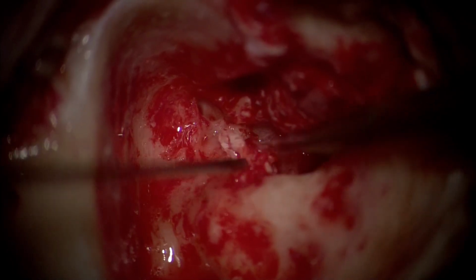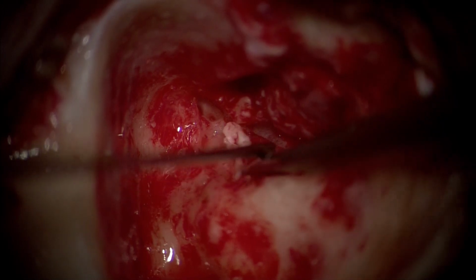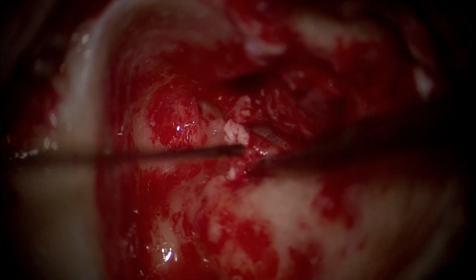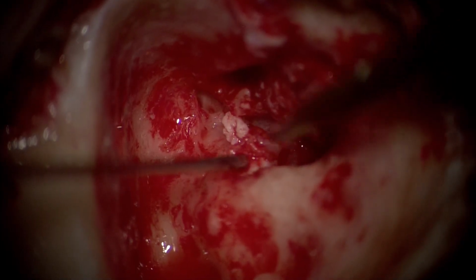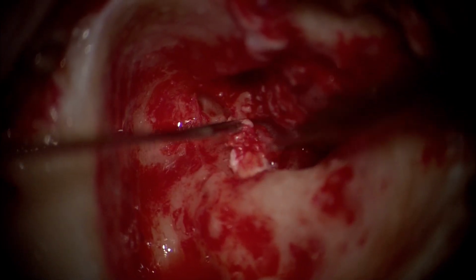Now, see here, what our palpatory instincts make us feel is that there's some remnant of the stapes, certainly not a complete stapes. Like you see, we are still resorting to sharp dissection and not completely blunt dissection, because we want to be very sure that we do not cause a subluxation of the footplate, which can be very unforgiving in patients.